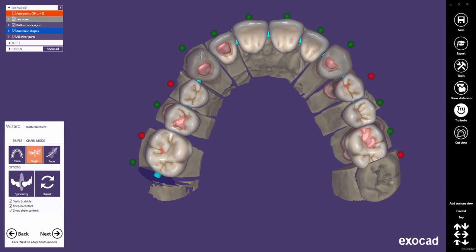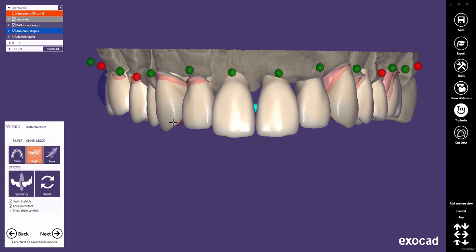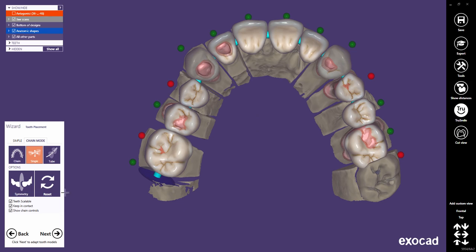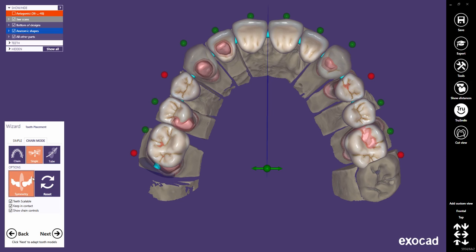Finalize the design in single mode. Let's try the overall symmetry. As you can see, the patient's left side has been mirrored to the right side.